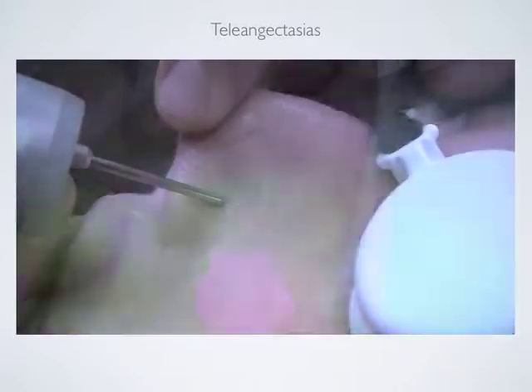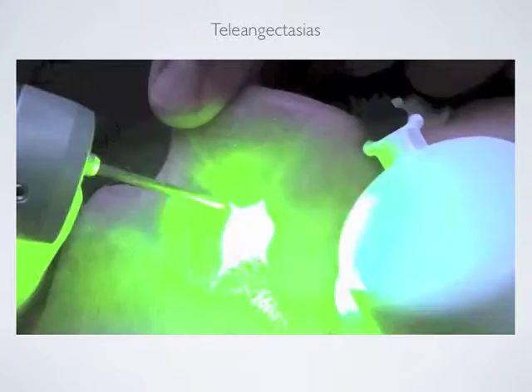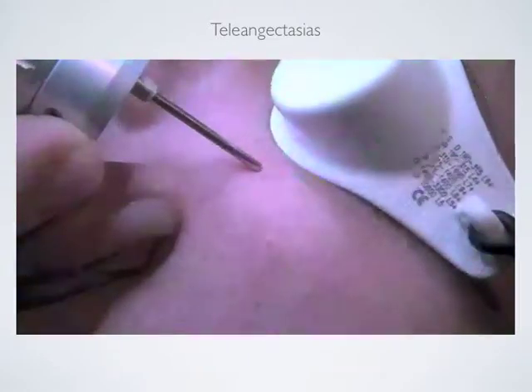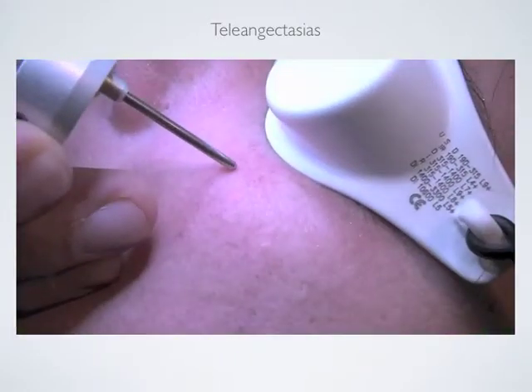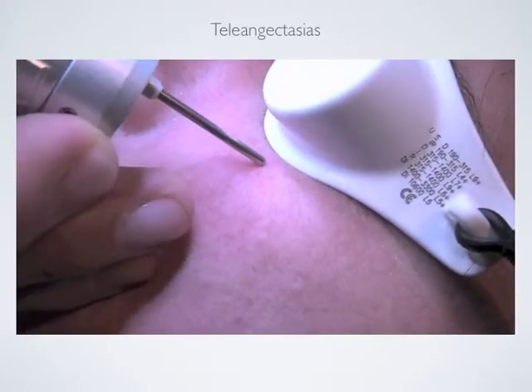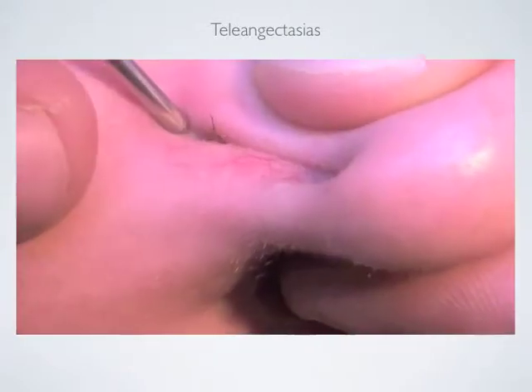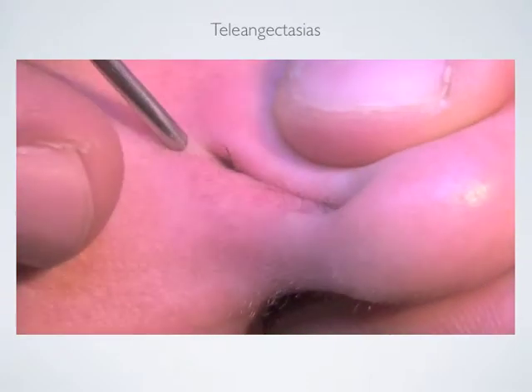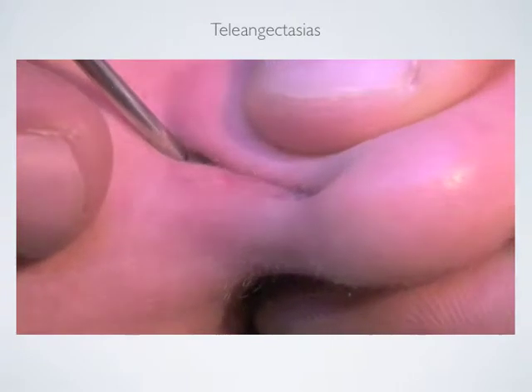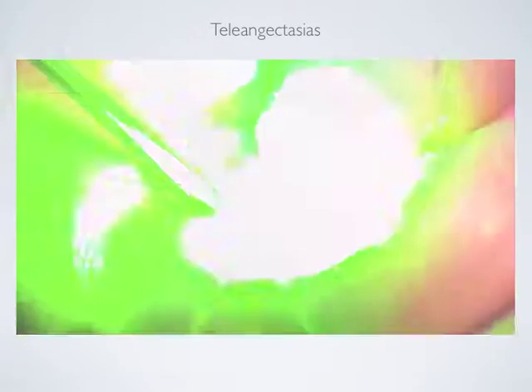Of course, getting closer to the nose means a more painful treatment. You should always keep the laser at a 90-degree angle towards the skin — this is the right way to hold it perpendicular to the skin. Hyperpigmentation becomes darker and you can go on treating another part of the face. The telangiectasia disappears. You actually bring the blood to a boiling point without damaging the surrounding skin. The skin is left intact, which means that patients can use makeup immediately after the treatment if they want to.